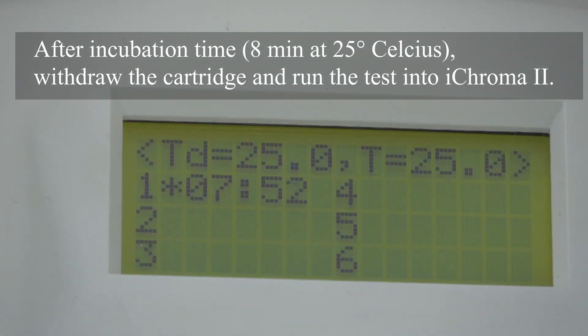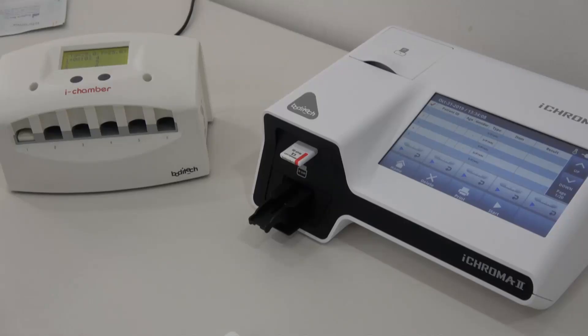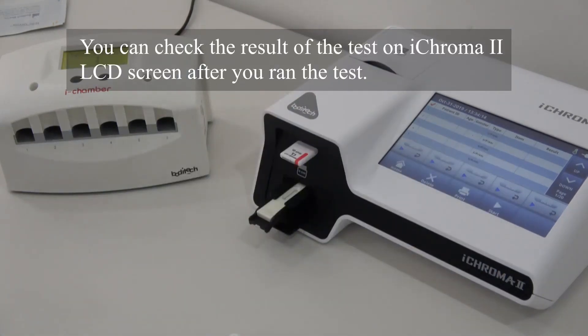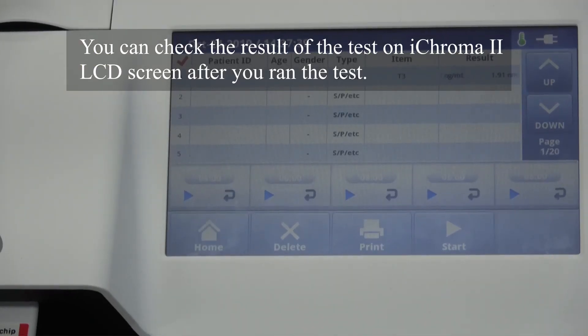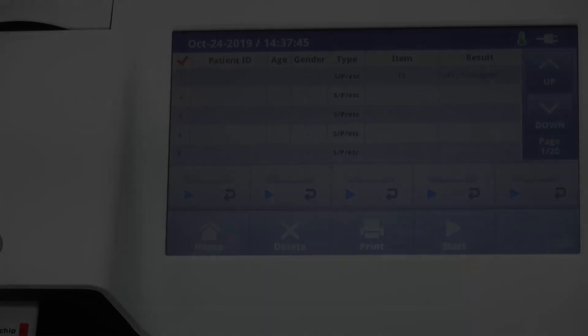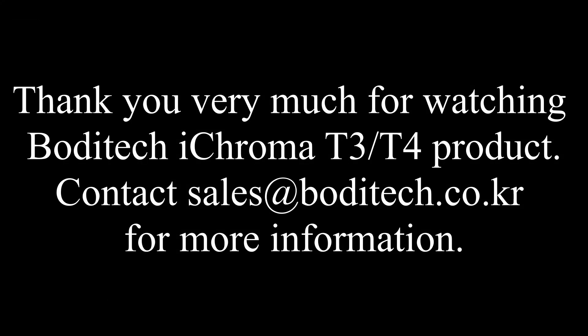After incubation time into iChamber, withdraw the cartridge and run the test into iChroma 2. You can check the test result on the iChroma 2 LCD screen after you run the test.